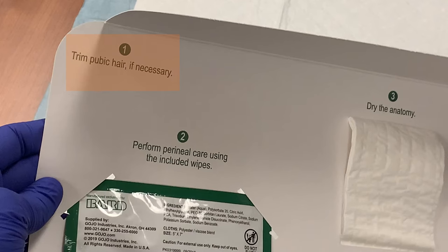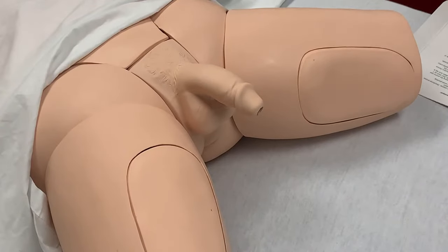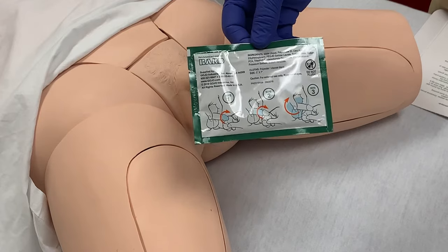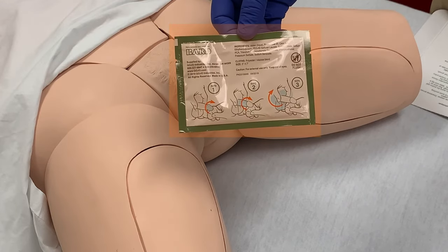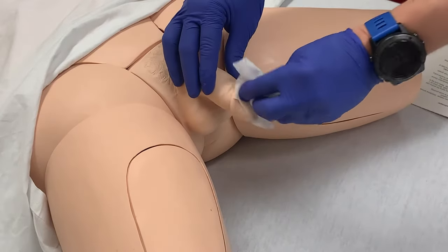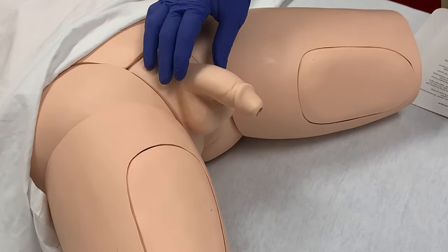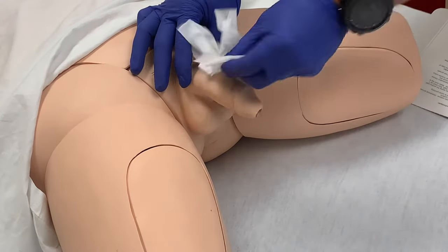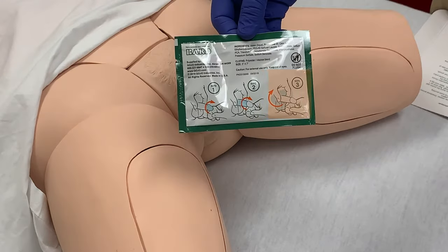Step one is to trim the pubic hair if necessary. With our dummy, this is not necessary, so we'll move on to step two, which is to perform peri-care with the provided wipes. The wipe packaging shows the three steps to use all three wipes to clean the penis. The first wipe is used to clean the head of the penis, starting at the urethral meatus and cleaning in a circular fashion around the head. The second wipe is used to clean the shaft, also cleaning in a circular pattern. And the third is for cleaning the scrotum.